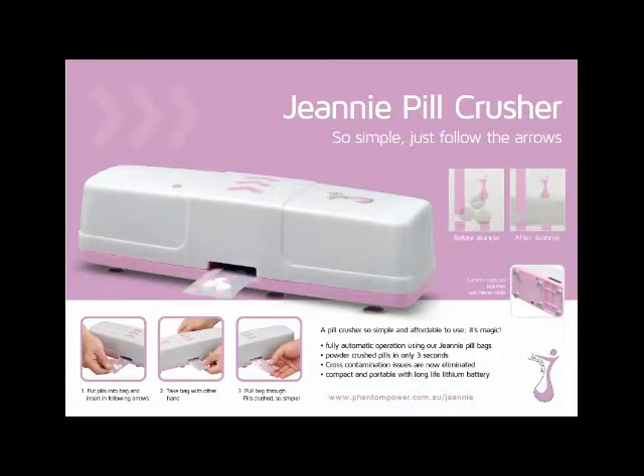Hi and thanks for purchasing the Jeannie Pill Crusher from Phantom Power Products. In this video we are going to show you how to charge the unit properly for reliable operation.